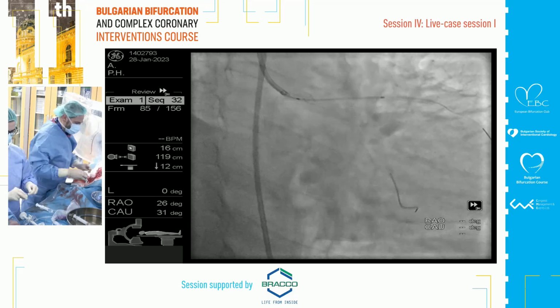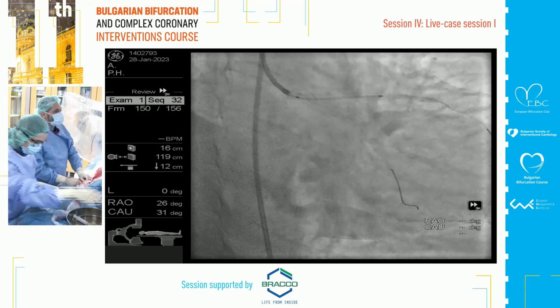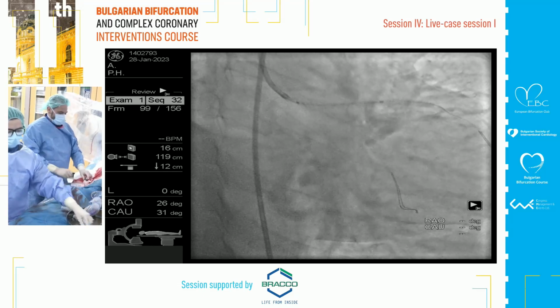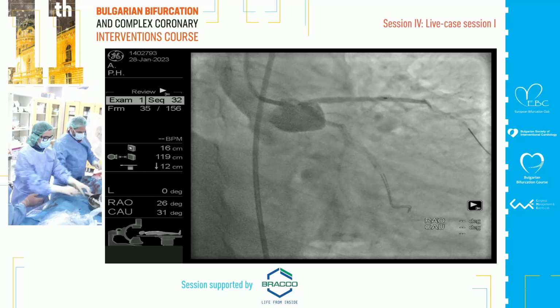We disconnected from the... a good one. Let's do the quick pullback. Can you push the pullback? Is this proper or not? Okay, perfect. 2.5, quick. Well opposed or not. Pullback. Running. Running backwards.